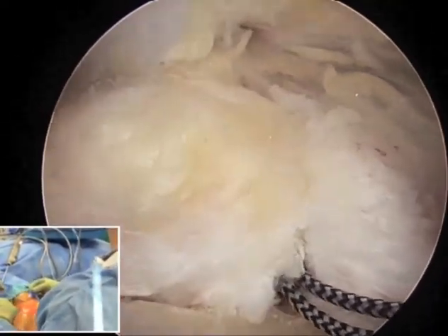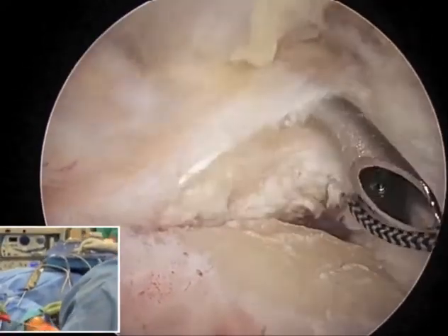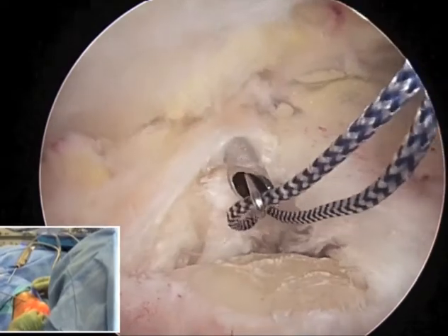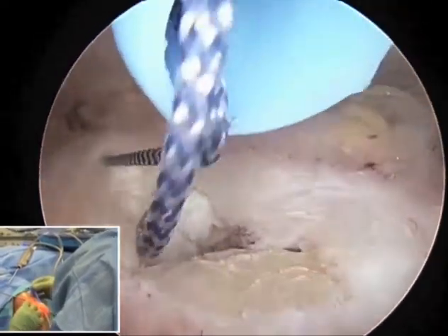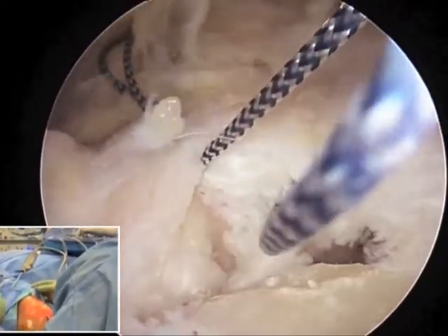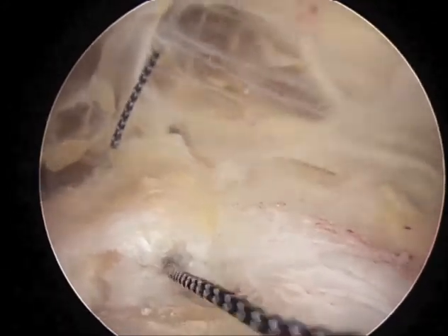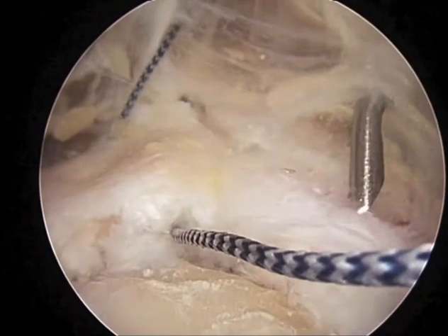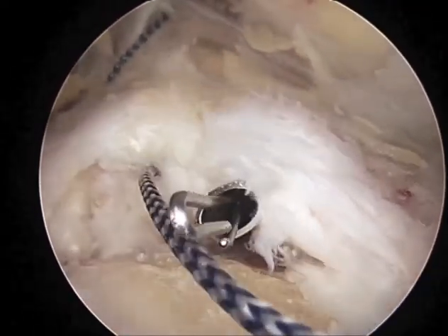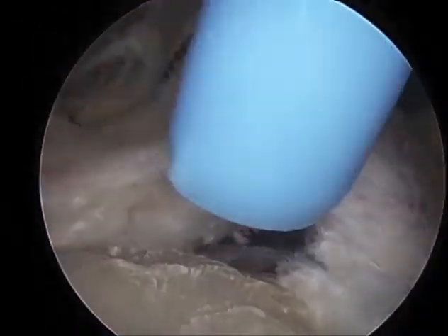We'll repeat this step on the opposite side of the triceps tendon. The ulnar nerve is some distance away and so it's not that much of a concern at this time. The medial proximal stitch comes back out through the tendon, and then we will repeat this step with the lateral aspect of the triceps as well. Again, this proximal portal is a single skin incision. The retrograde retriever now comes more to the lateral side — obviously that's safer — and we'll grasp our suture, giving us four passes through this triceps tendon.